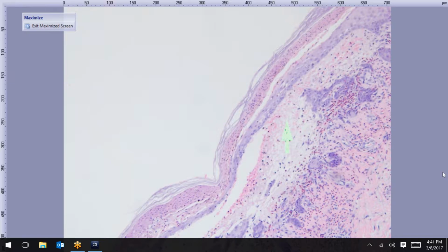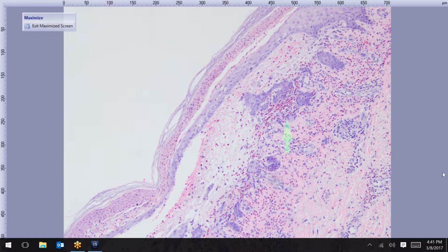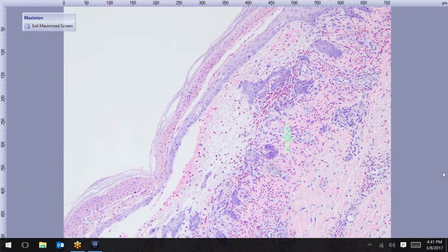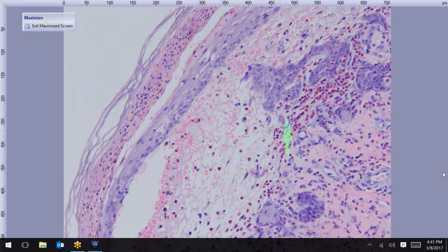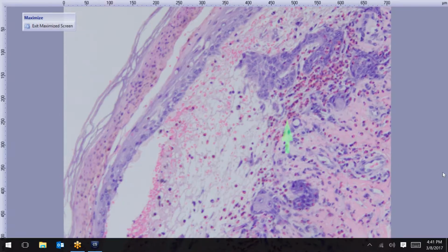So we are in another category of, what would you categorize this as? Subepidermal. And there is some spongiosis. Yeah, we got some eosinophils, but even more so, it's subepidermal cleft formation. So, yeah, bullous. Yep.